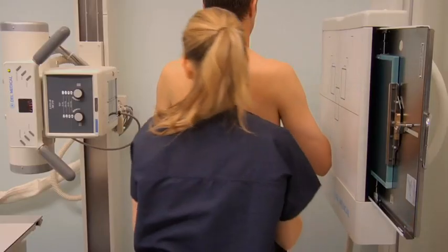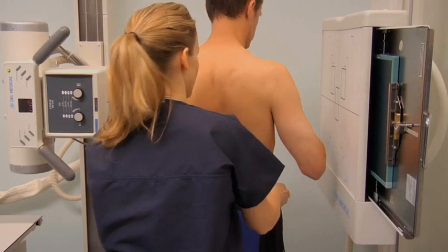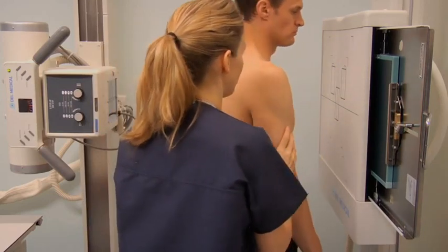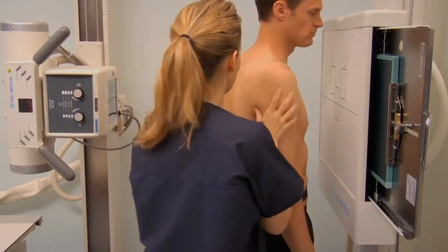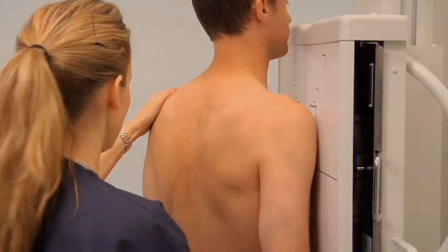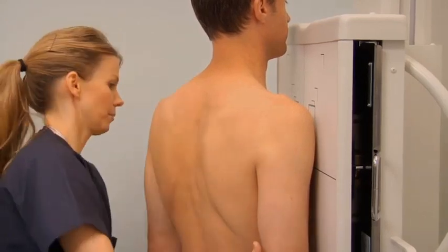Ask the patient to stand with the front of their chest against the IR. Rotate the patient's left side 15 to 20 degrees away from the IR.